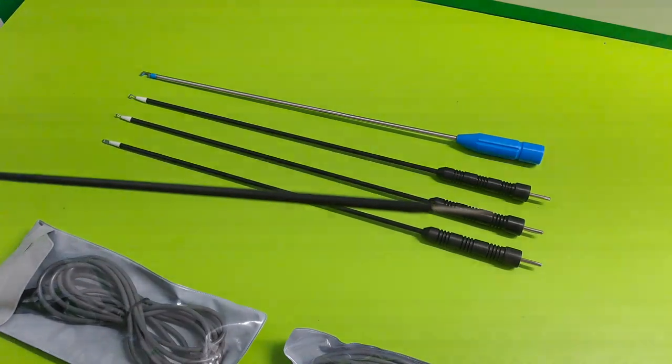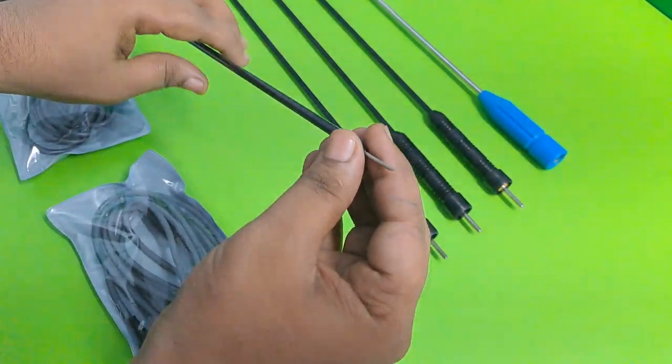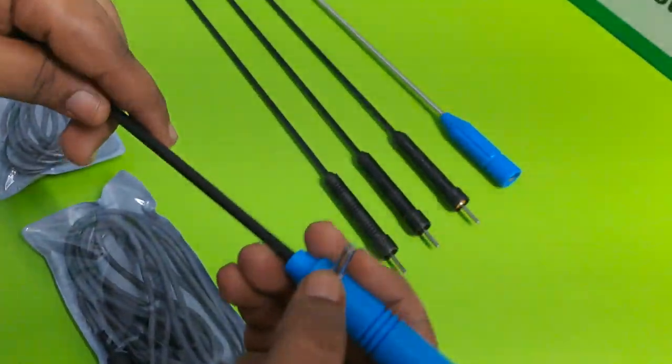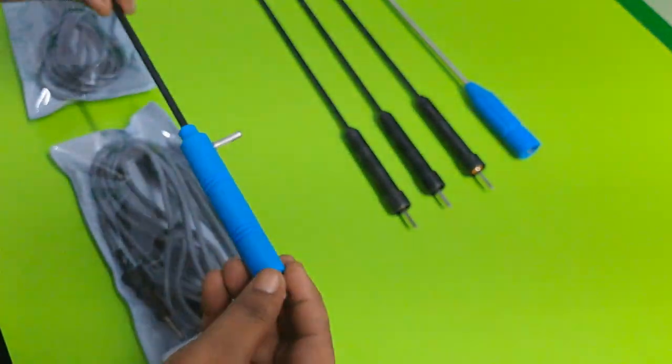Now you can see here, the sharpness is here, in this size. This is the Monopolar Pin — you can easily attach the Monopolar Pin for current.